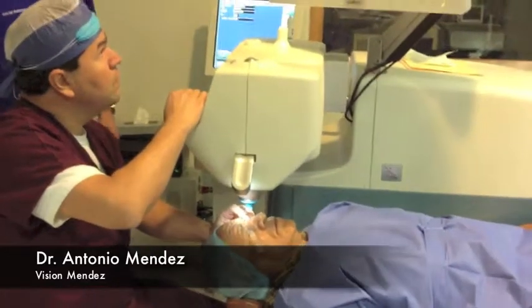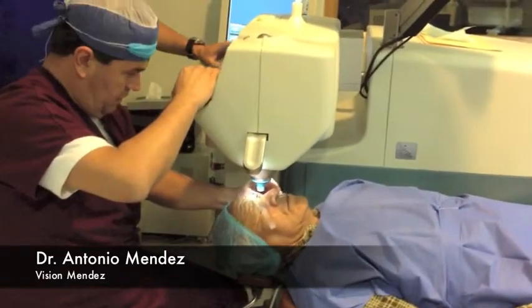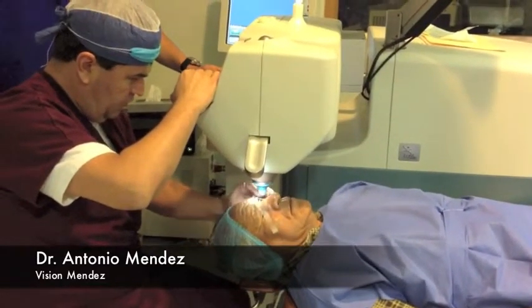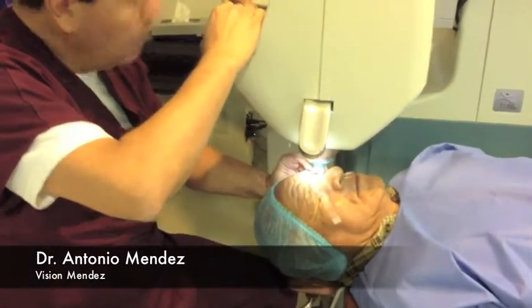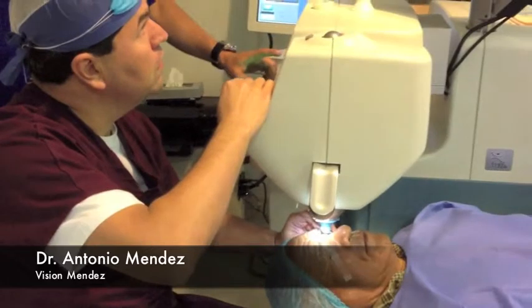When performing femtosecond laser assisted cataract surgery, first we need to make sure the laser recognizes and is aligned with the patient's eye. This is called docking.